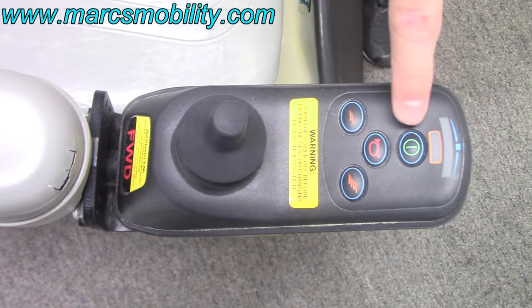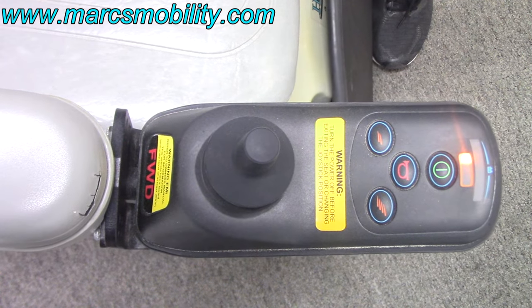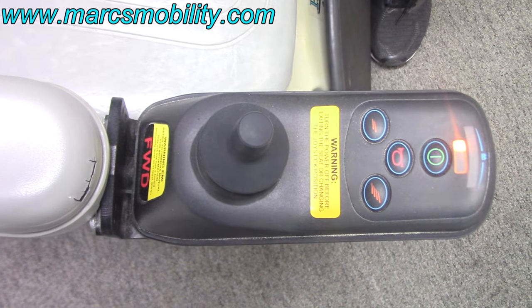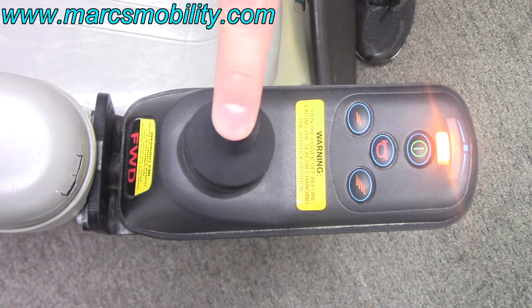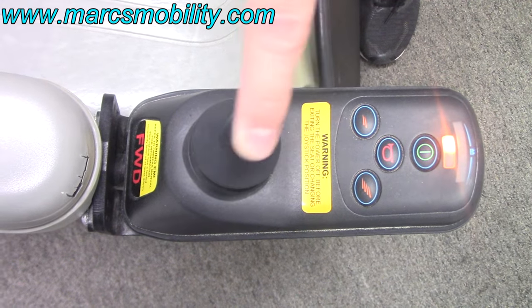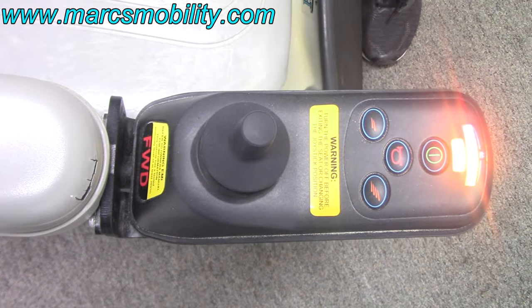When you turn it back on, you're going to see your lights begin to scroll back and forth — that means it is in the lock position. To unlock the joystick, you hold the joystick forward till it beeps, then hold it in reverse till it beeps, let go, and now you are unlocked.